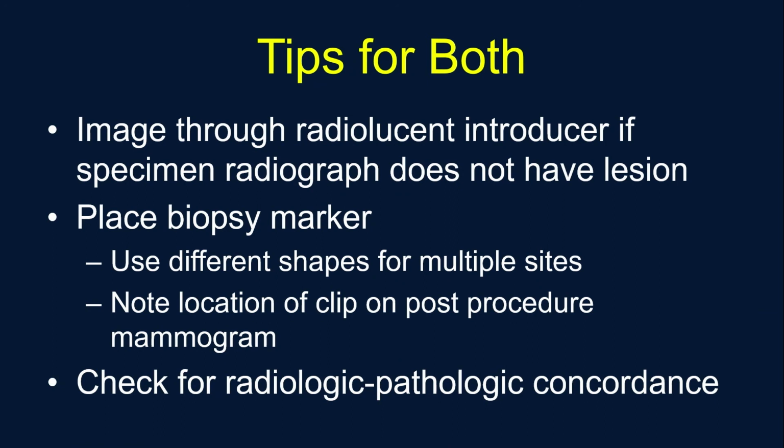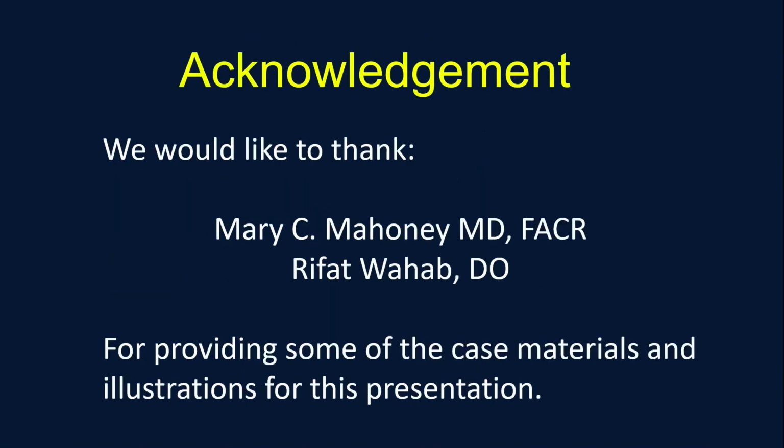And you want to place a biopsy marker, and generally most of us know this, but we're using different shapes for multiple sites. You want to note the location of that biopsy marker on the post-procedure mammogram in your addendum, so that if the patient does end up needing further intervention like a localization, your colleague who inherits that case has a much better chance of knowing whether the target is the clip or a couple centimeters away. And of course, check for your radiologic pathologic concordance.